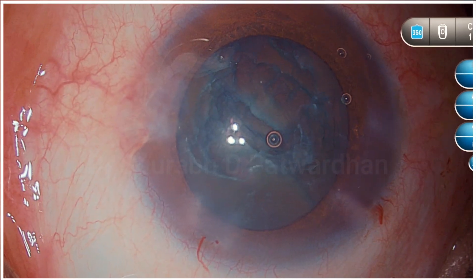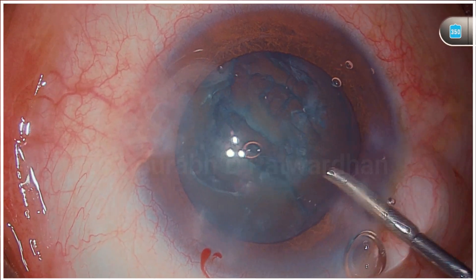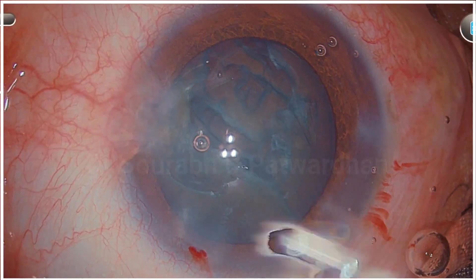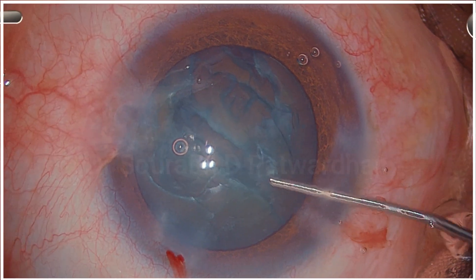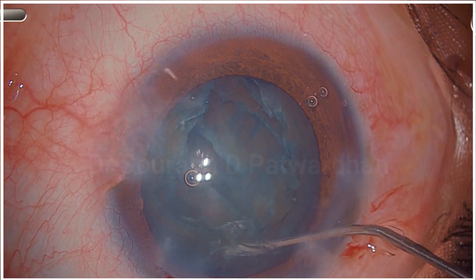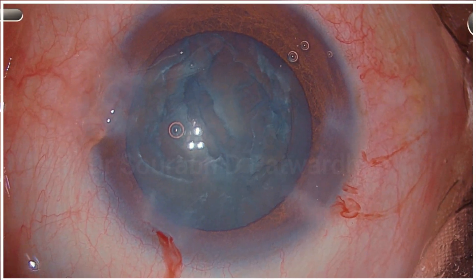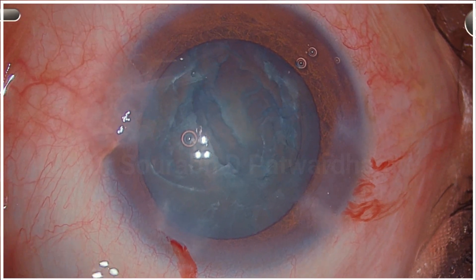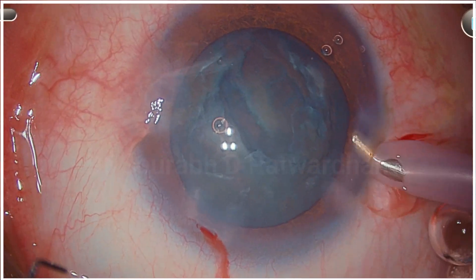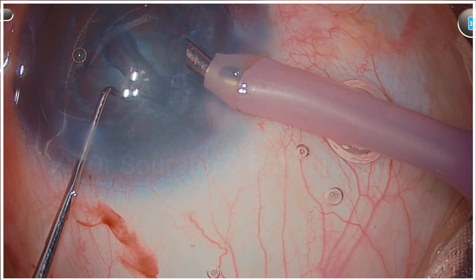To repeat hydrodissection, it is essential that you go under the anterior capsule till the periphery and push some fluid. Here you can push more fluid because you have already divided the nucleus, so there is no chance of hydro rupture of the posterior capsule. Push more fluid, and you will find that here when I push fluid, there was anterior movement of the nucleus, and now I know that the nucleus is separated from the bag.